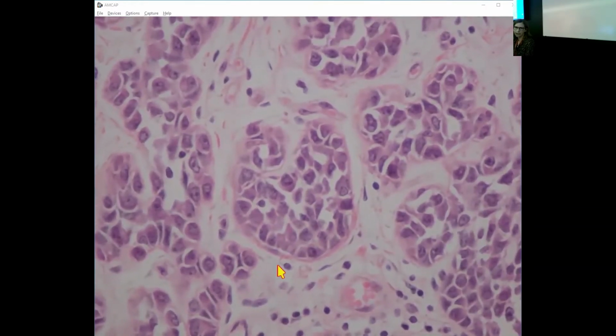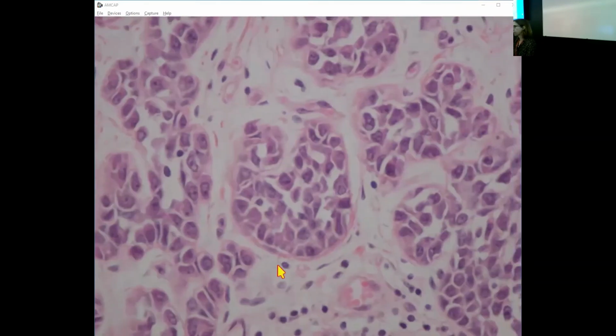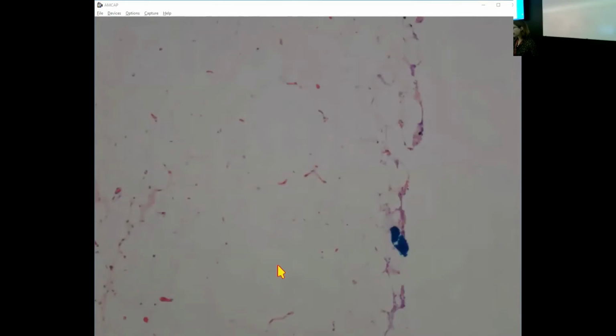Pleomorphic LCIS, this one, yeah. So pleomorphic LCIS on core biopsy, they would get an excision. So they'd certainly have an excision. And then for how the patient is managed beyond the excision, it's not well defined, I would say.